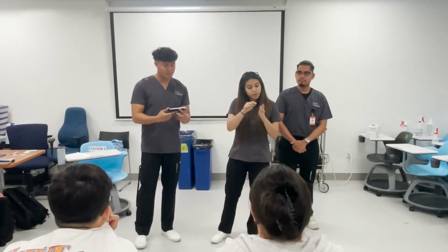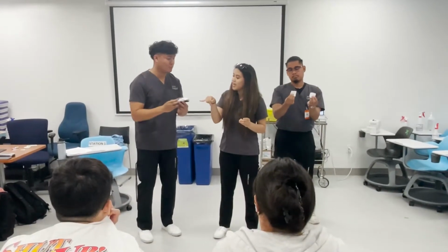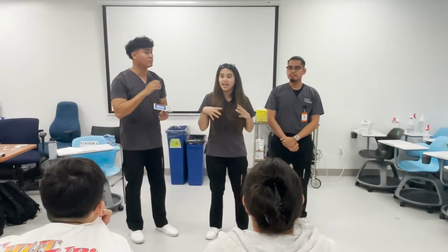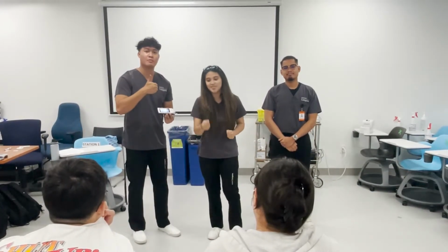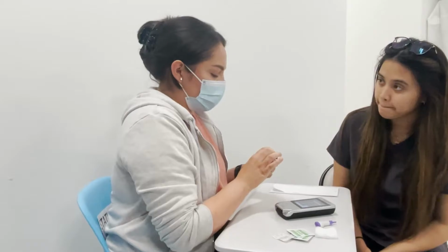And then after you've pricked your finger, you're gonna wipe away that first drop of blood. Then you're gonna use the second drop and apply it to the glucometer, just like that. Once you get your reading, then we're gonna record it and we're gonna do whatever comes next. Sound good? Yeah. Okay, so now we're going to go through the one-on-one and you guys can get some hands-on experience.